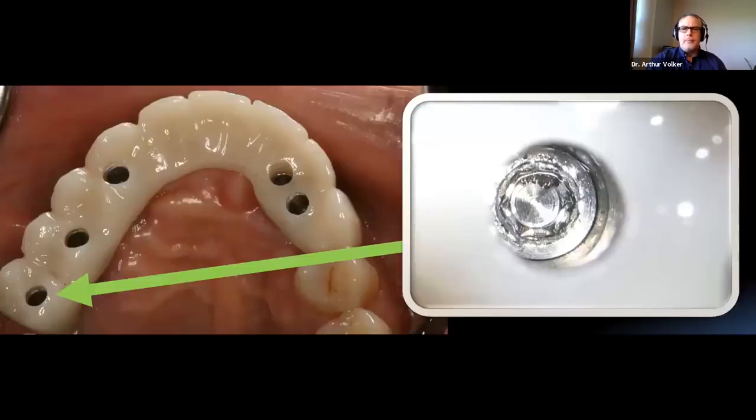Anyway, the other thing, and I just threw this out there because I'm a big fan of this thing, is to use an operating microscope. Once you start, it's like a drug, you can't stop. But I have been using a microscope for the past 6 years prior to my involvement in a laboratory. The beauty of it is you can really see everything you need to see, and it really makes dentistry a lot more pleasant.